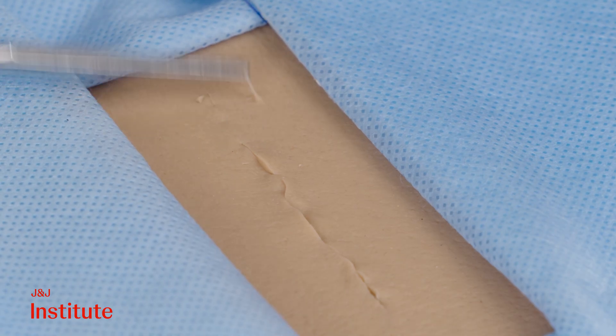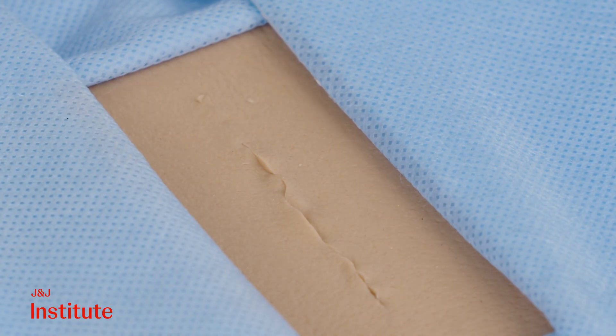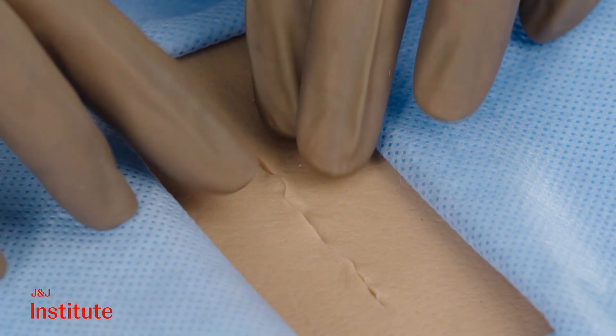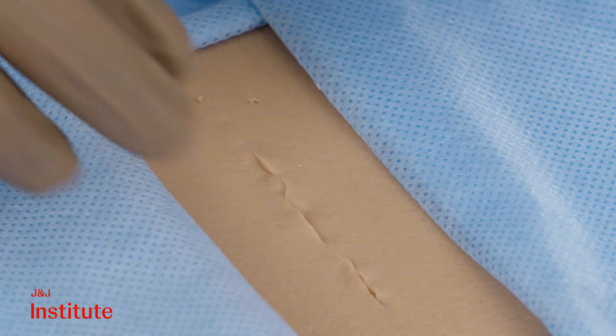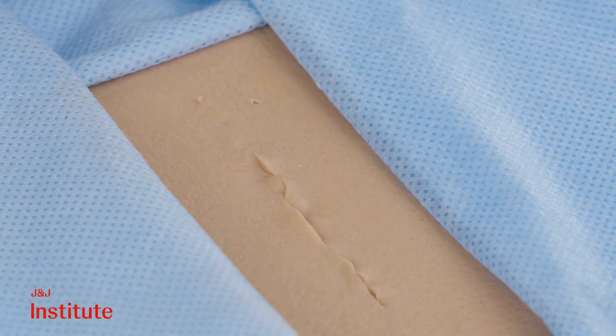The suture is then trimmed flush with the skin. The spiral design of the suture streamlines closure, ensuring optimal wound edge apposition and eliminates the need for knots.